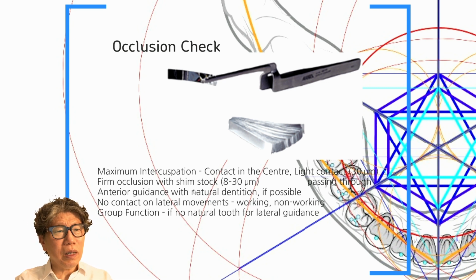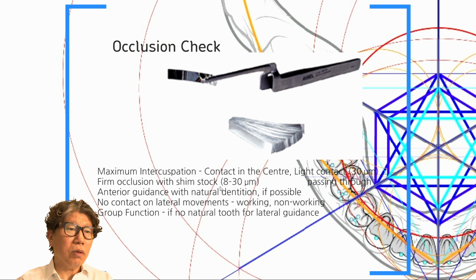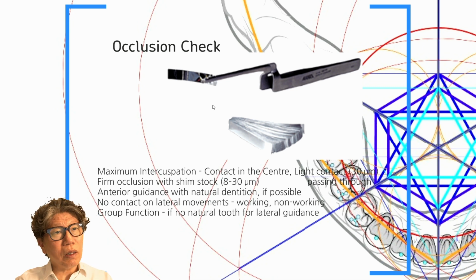Therefore, every director checked the shim stock, and it seems they are still doing so. When talking with our hospital staff, they say that they still hear about this practice being done elsewhere recently. That's why there is talk of continuously purchasing shim stock. There is no need for that. If you stamp it on occlusion paper, the degree of occlusion comes out accurately.